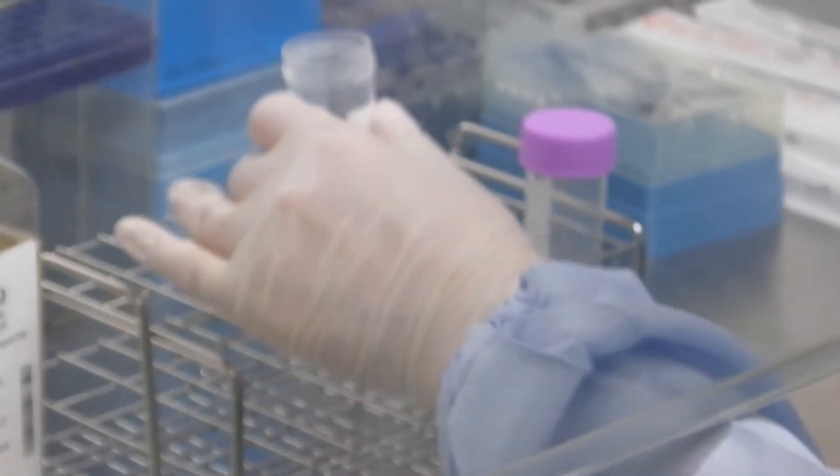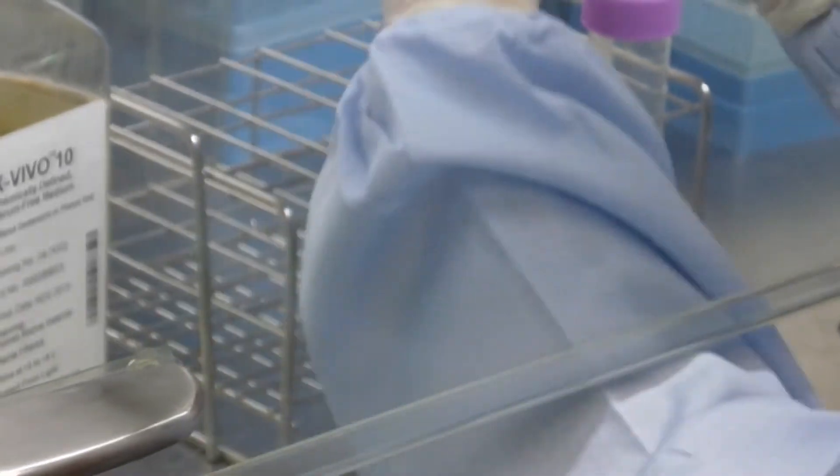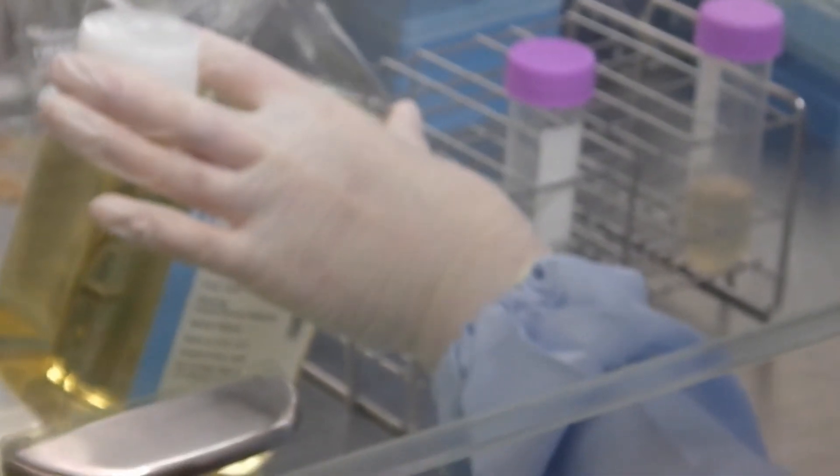After centrifugation, the supernatant is removed by aspiration. Then 6 milliliters of stem spin ACF is added to make a sample for pre-culture.